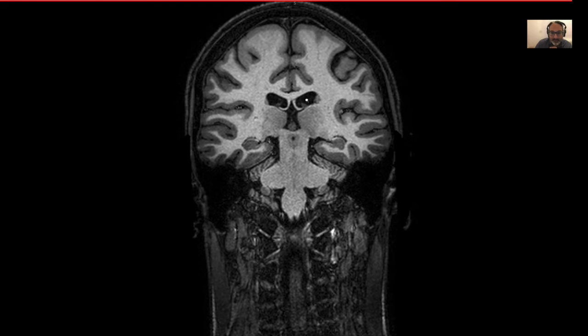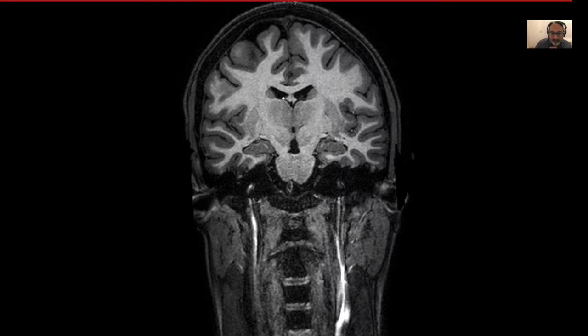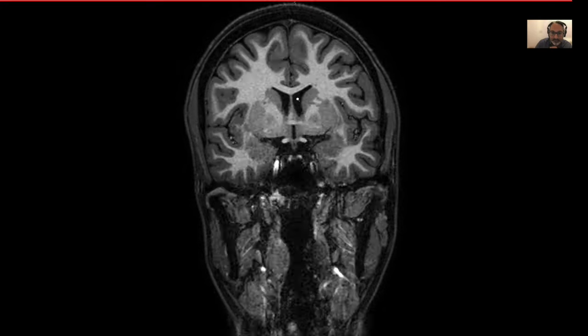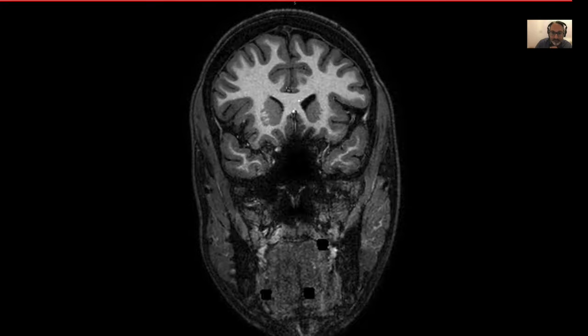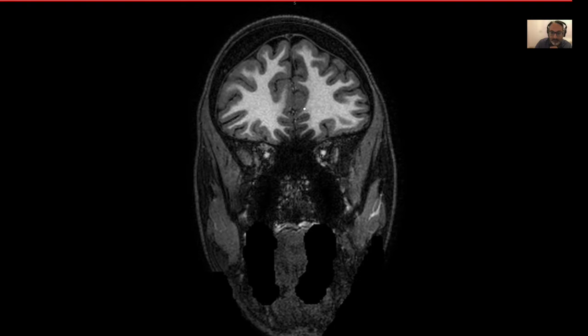These again are your lateral ventricles. Here you're going to see the lateral ventricles, with the interventricular foramen draining into the third ventricle. I'll keep following the lateral ventricles all the way to the anterior, and there the lateral ventricles vanish. This is now your frontal lobe. So let's do the ventricles first this way.